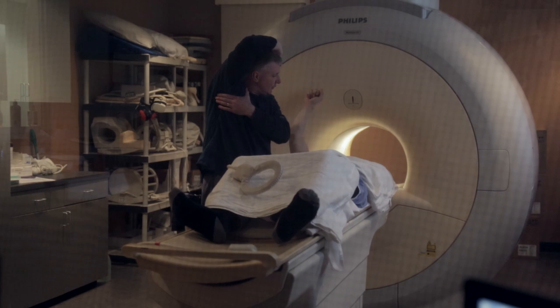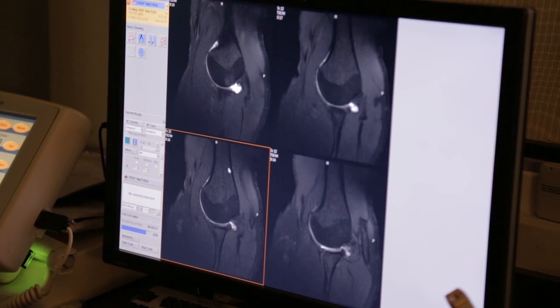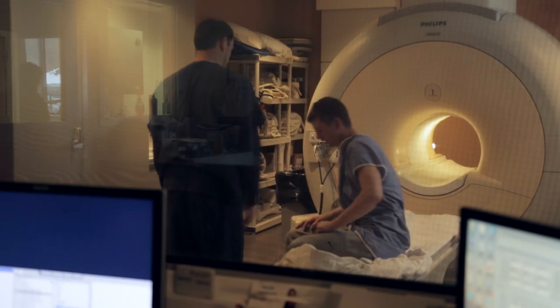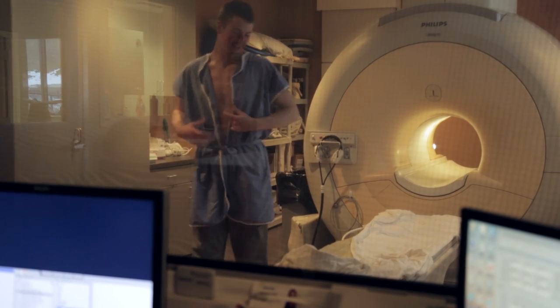After the fluid is injected, the MRI scan captures images of the joint, which helps your doctor plan your treatment. Just trying to get this done as soon as possible instead of pushing it off and making it worse. For Matt, that may mean surgery, but it will hopefully bring relief.